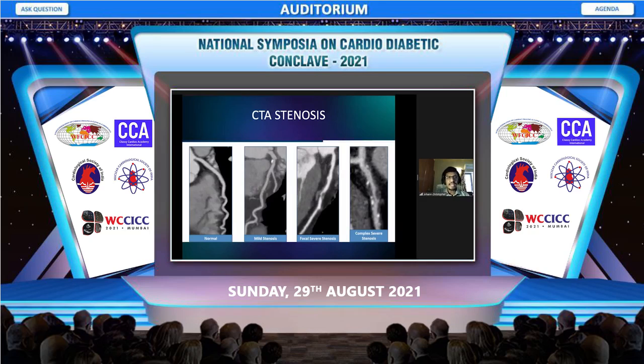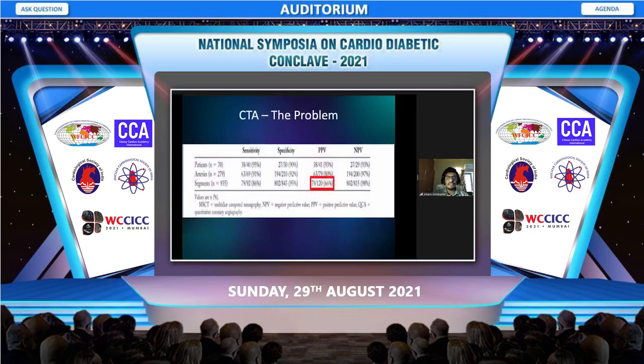While the CT is excellent in the two extremes, that is a normal and mild lesion, and of course in the significant lesions, it just does not cut it when it comes to the borderline lesion, which incidentally is almost 1/3 of all our work. What happens here is that the positive predictive value really falls to less than 70%, with a high 90s in the sensitivity. Now, how are we going to overcome this?